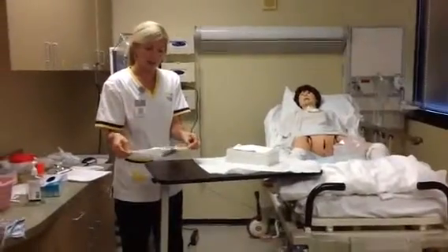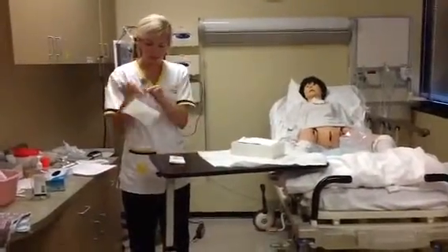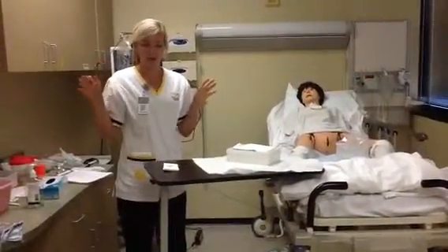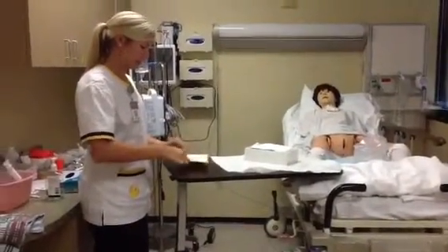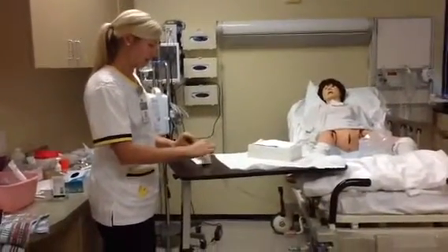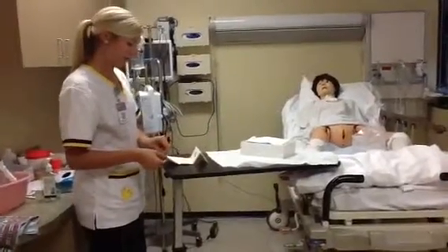Go ahead and open my gloves up, set them out, throw this away in my trash. I'm really going to try and not ever drop my arms below my waist. So I'm going to come over here and open up my gloves. The outside of the package is not sterile, but as I get closer, I'm going to open from the bottom.